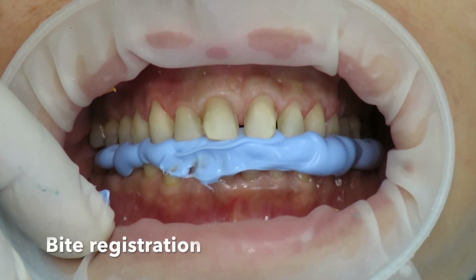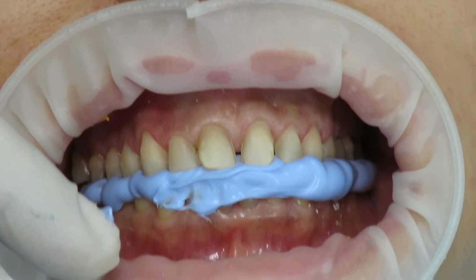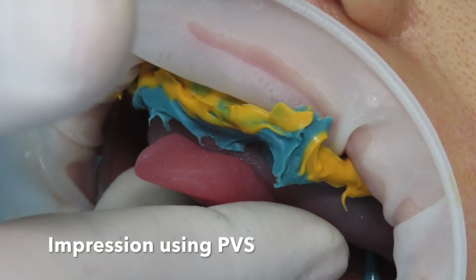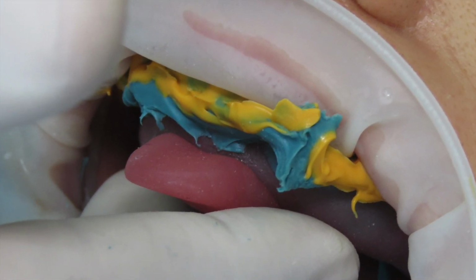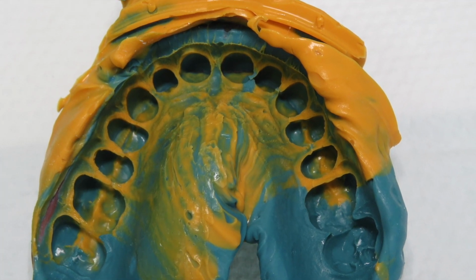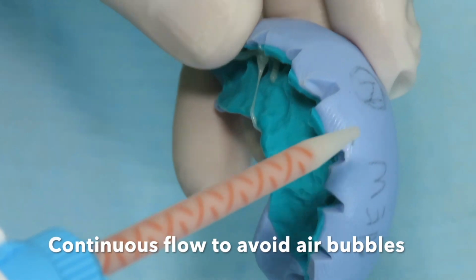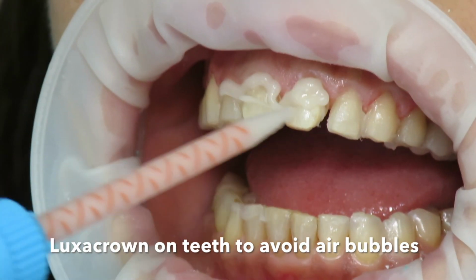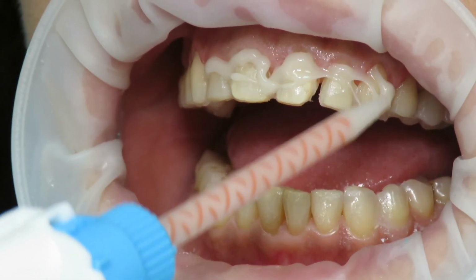In this situation, we did it in two ways. We did it the conventional way using a custom tray with some silicone, and we also used the digital impression. We decided to do both just for records and, of course, after agreement of the patient.